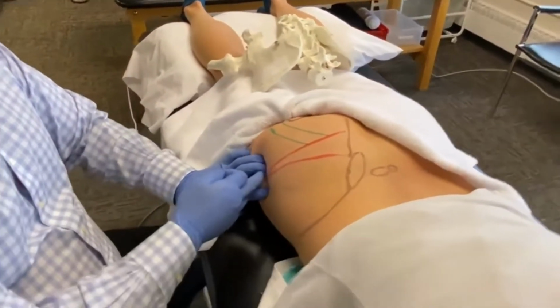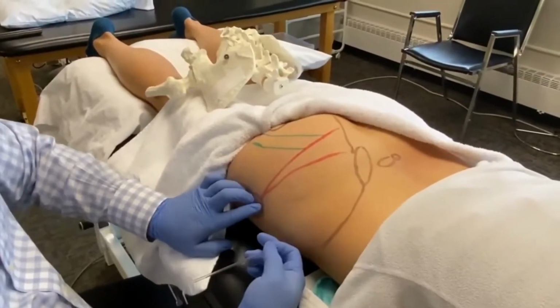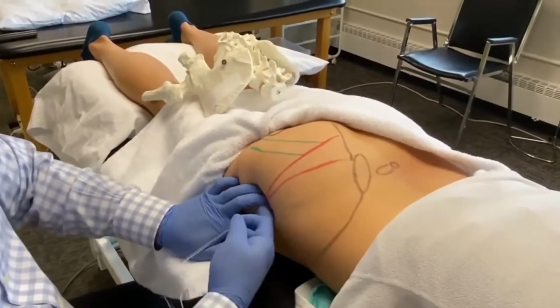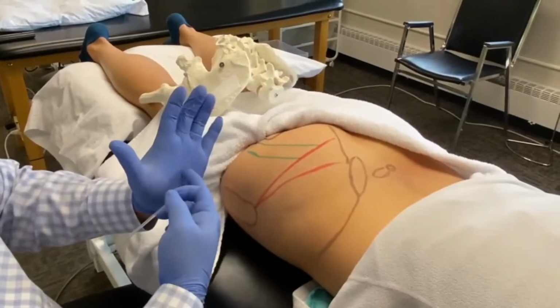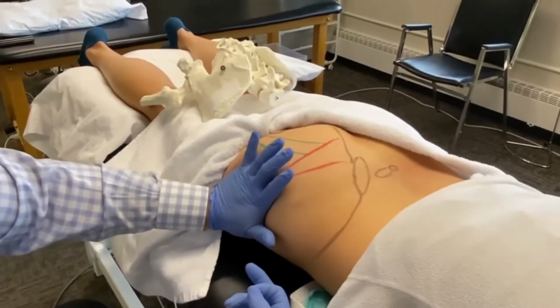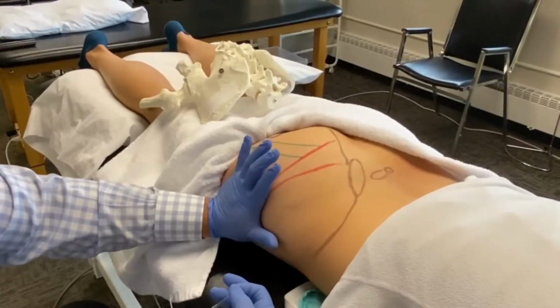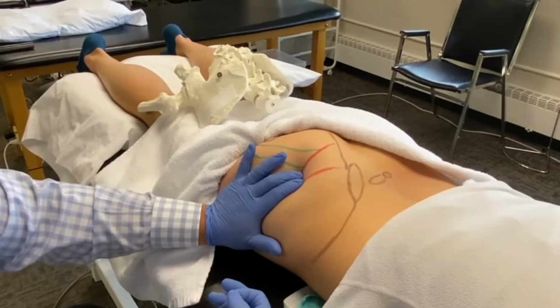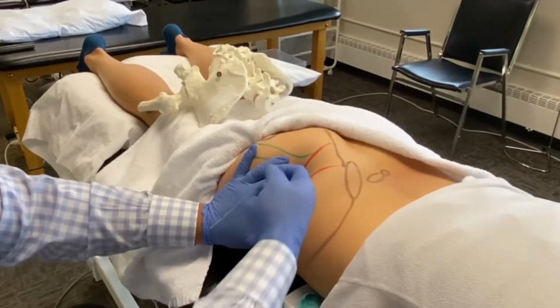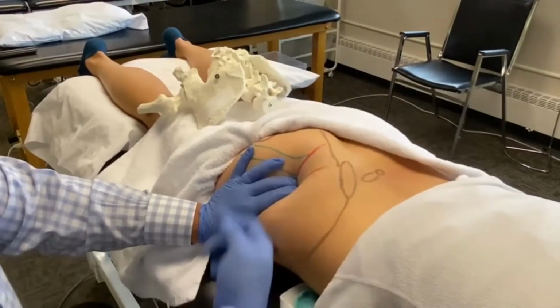What we're going to do is identify the piriformis by first finding the greater trochanter. Take the palm of your hand and place it right over the lateral aspect of the greater trochanter, and allow your fingers to fall over the soft tissue as it travels towards its proximal attachment.